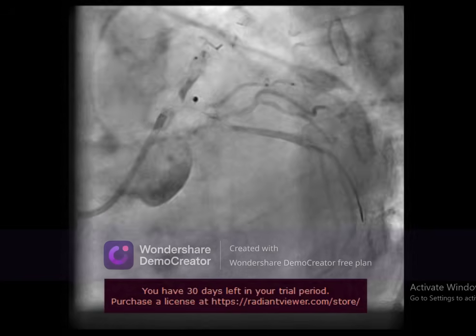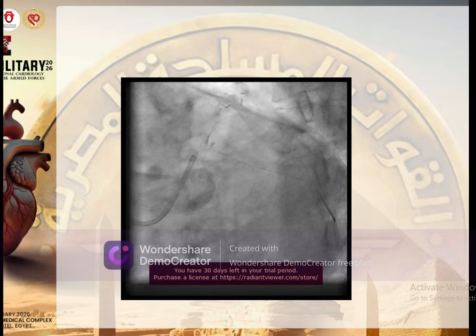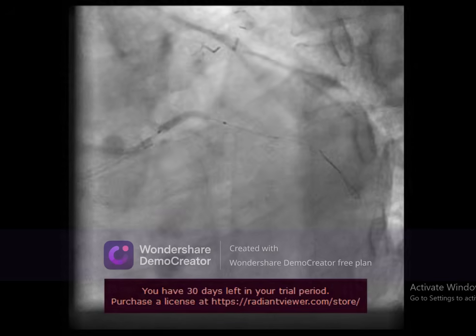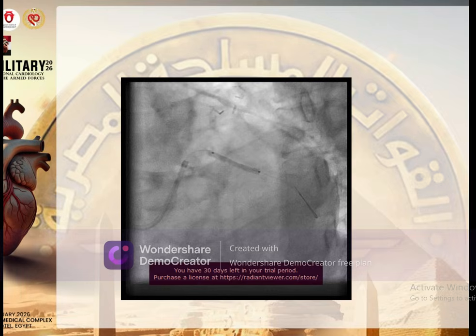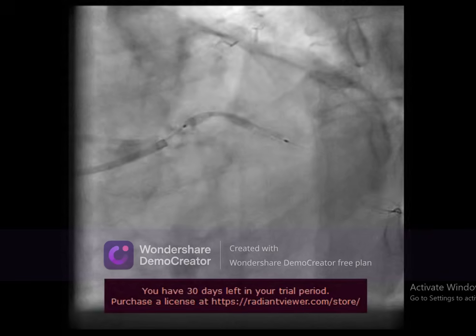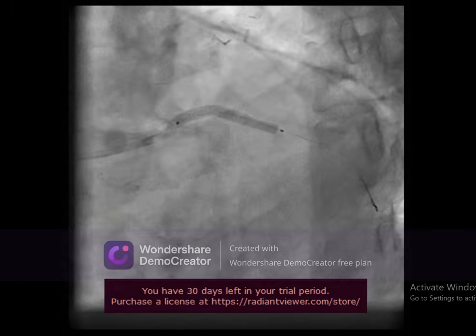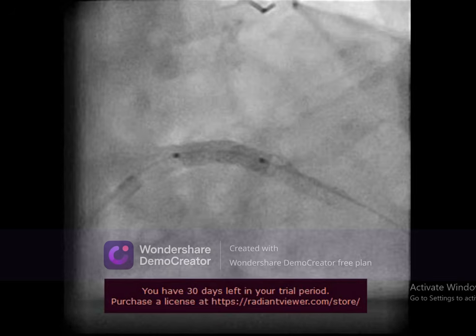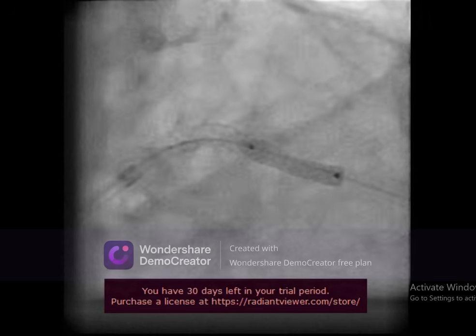So we went directly to do a coronary intervention of the distal left main, crossing over to the LCX with a simple Floppy wire, and pre-dilatation with a regular balloon. Then direct stenting with a POT, as we see here.